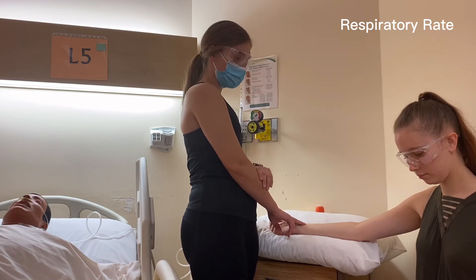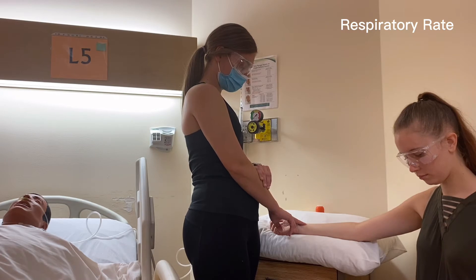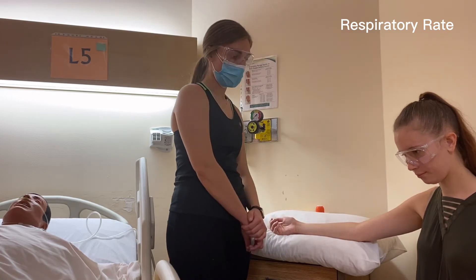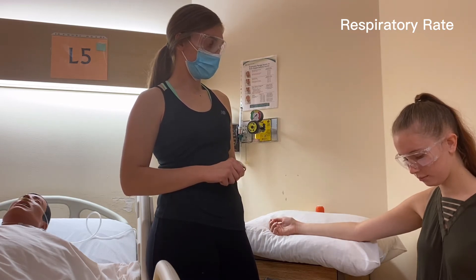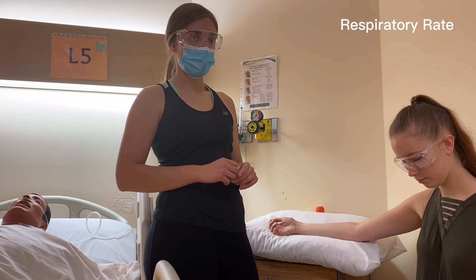It looks regular, so we're going to do a 30-second time period. We note that the pulse rate was 98 beats per minute, taken from the right arm, and it was regular. For the respiratory rate, we note that it was 20 breaths per minute and that it also appeared regular.